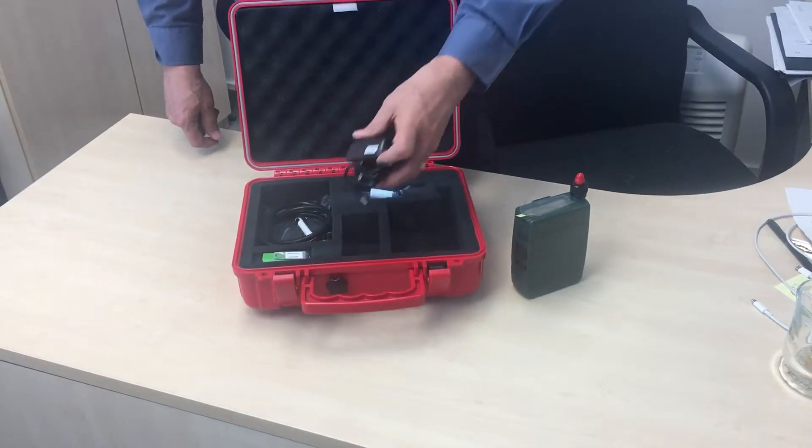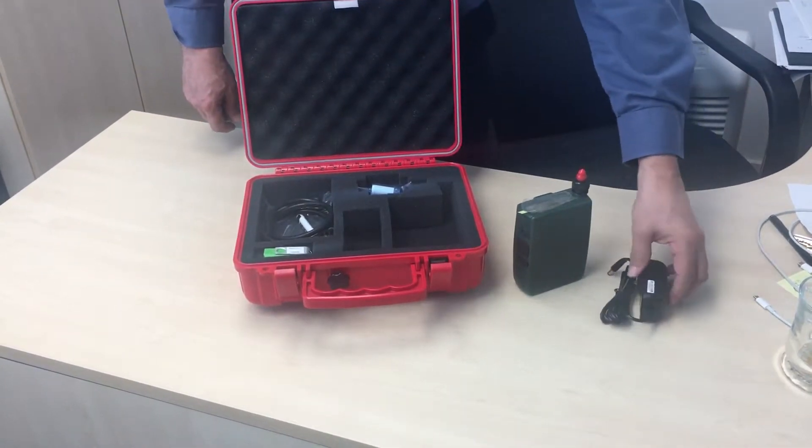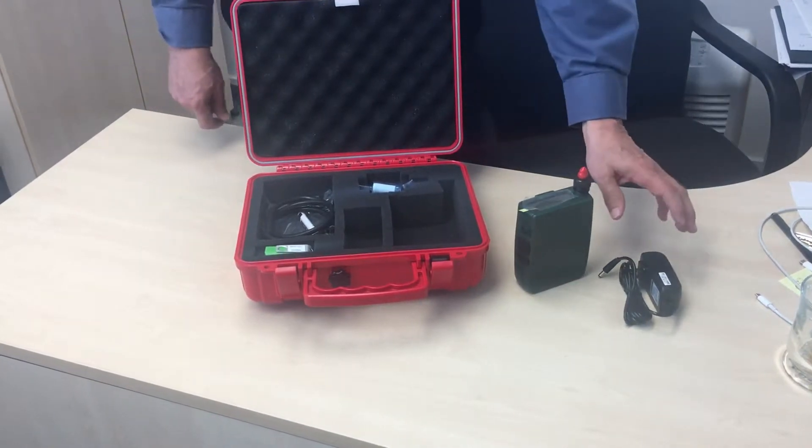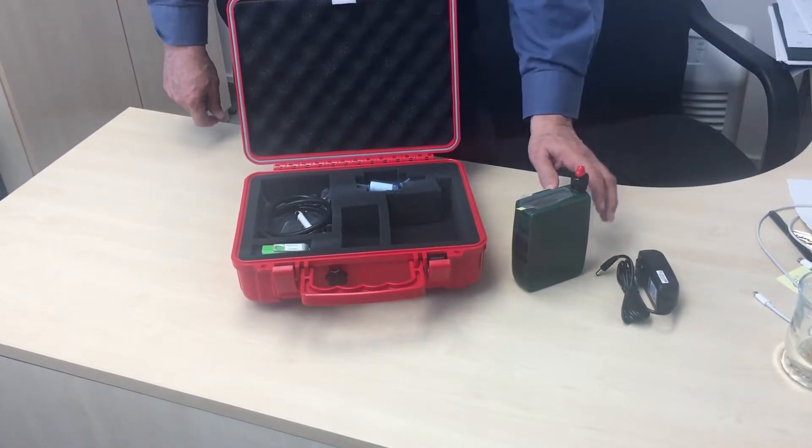Next is the power adapter that plugs into the wall and charges the unit. You must use this power adapter with this device.